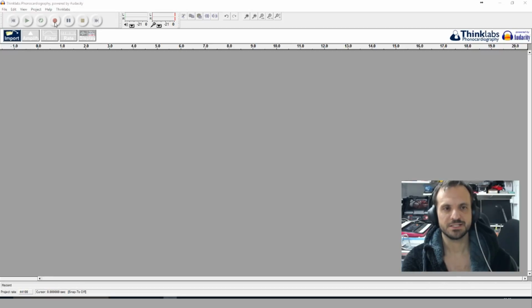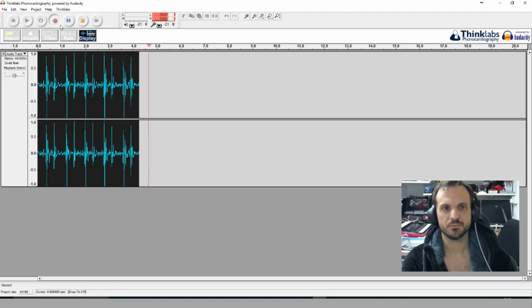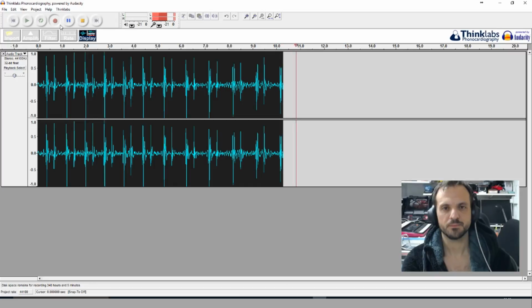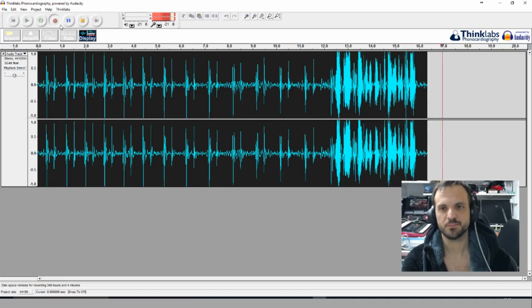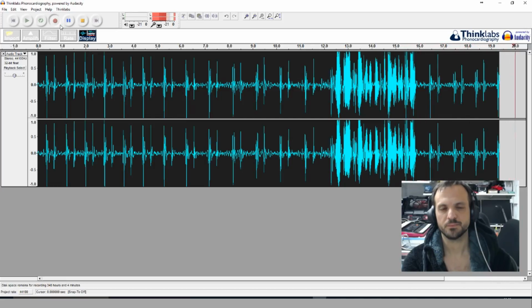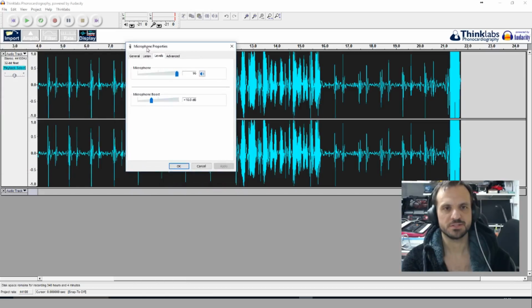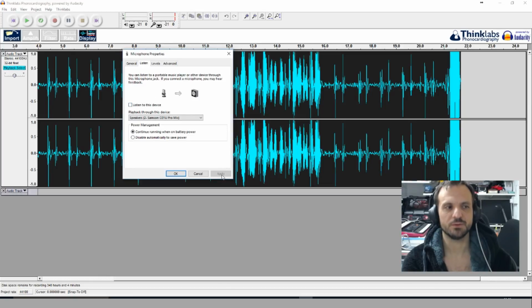So I'm going to just hit record. And I'm trying not to talk, obviously. You can see what happens if I do. You heard that? That was my stomach rumbling there. So what I'm going to do is use this microphone setting, and you can see I've got the gain right up here. And I'm going to turn off listen, and then, ooh, there you go. That's a lot better. Should make it a lot quieter for you.